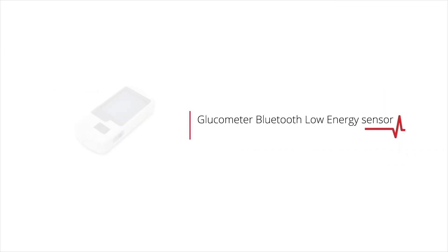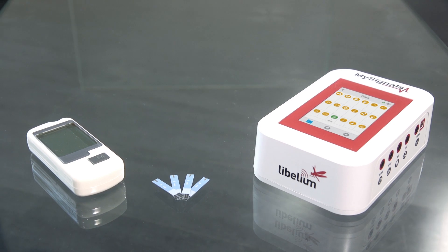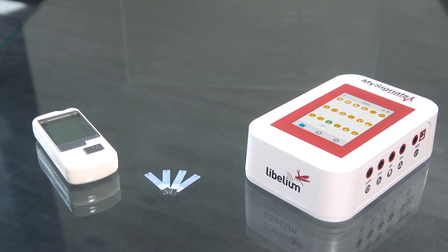How to use the Glucometer Bluetooth Low Energy Sensor in MySignals. Bluetooth Low Energy Sensors are paired with the MySignals development platform. You only have to switch on the sensor to send data wirelessly to the MySignals board.